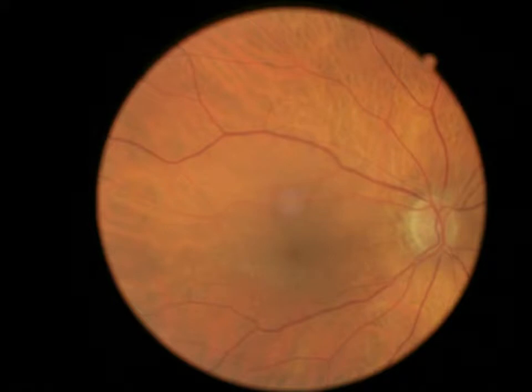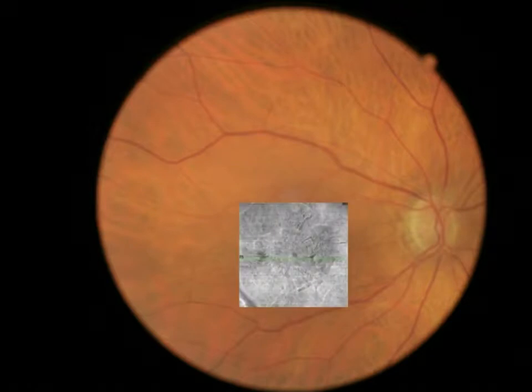Now again, this is a fundus photo of somebody with an epiretinal membrane. And as you can see here, after I've highlighted it, and you know that it's an epiretinal membrane because it's coming after the title slide entitled Epiretinal Membrane, you can actually get a sense and see it. You can see that it's slightly cloudy around the fovea, and you can even see the fovea almost has kind of a cherry red spot around it. But these are difficult to tell. And what we've realized is there are just more epiretinal membranes in our practices than we ever thought there were.